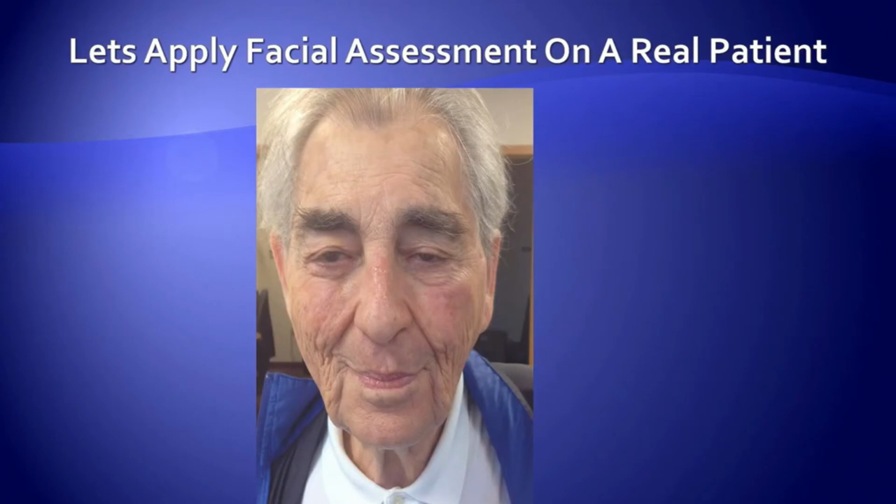Look at the bridge of the nose, look at the sides of the face, the frown lines, look at the lips, the corners of the mouth, the skin, the cheekbone, and look for asymmetry. Just scan this as you would one of your own patients. And also think about what kind of mask you would fit on this individual. We'll just say that his pressure is 30.